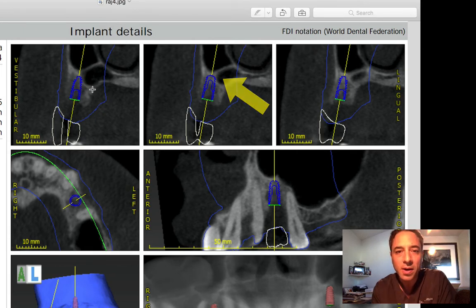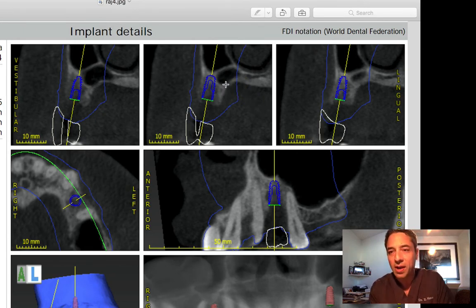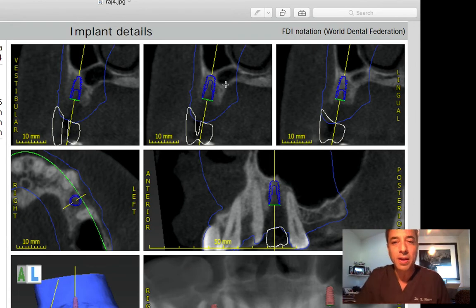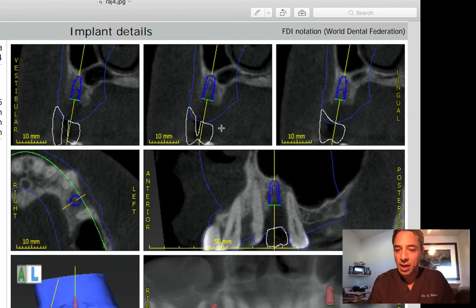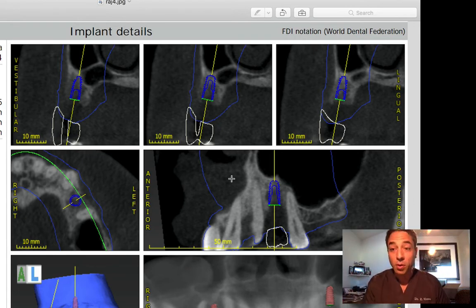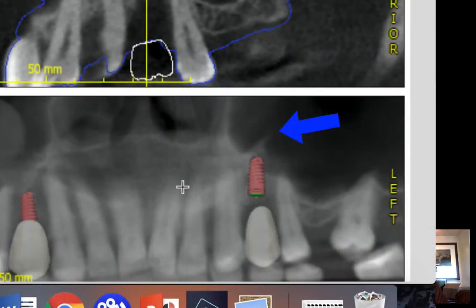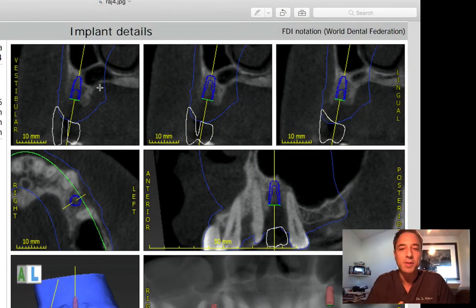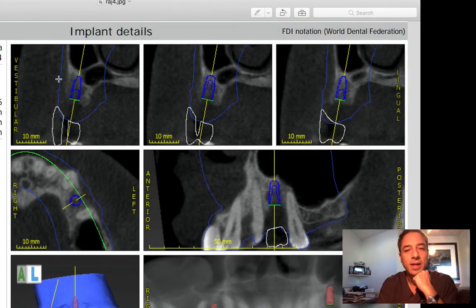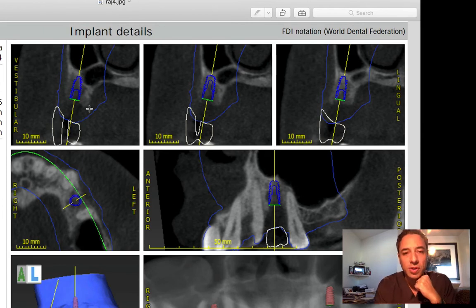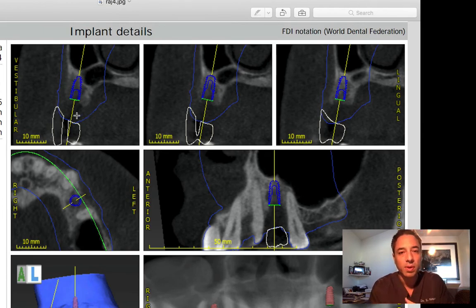You can tell that there is a compartment here in the sinus. Totally fine — you don't need to get in there, but it's a good observation. Sometimes you see a hint of it in the panoramic view right in here. But actually, this is going to be a blessing in disguise because this is where you can anchor your implant and get additional stability considering the poor quality.